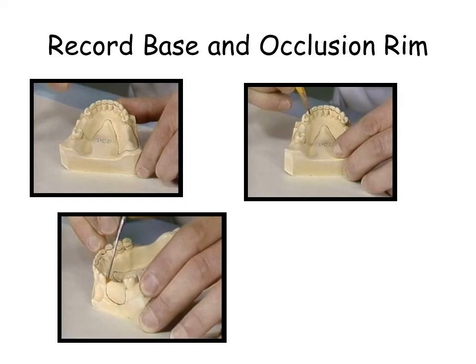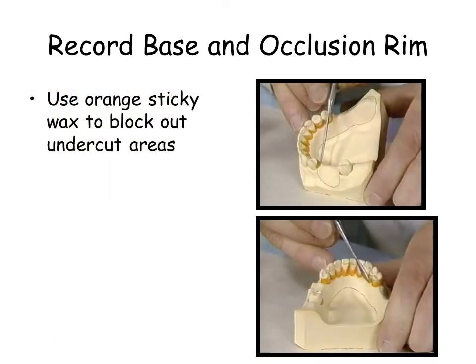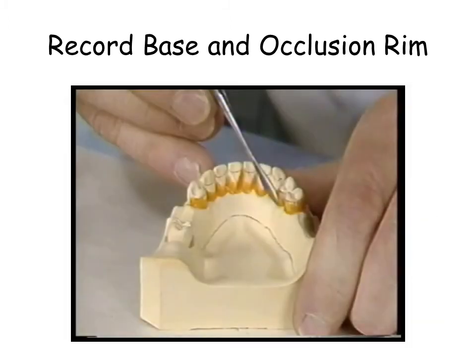The cast should be dry. Using orange sticky wax, block out undercuts, as seen in the illustration. Use red rope wax to outline the record base.